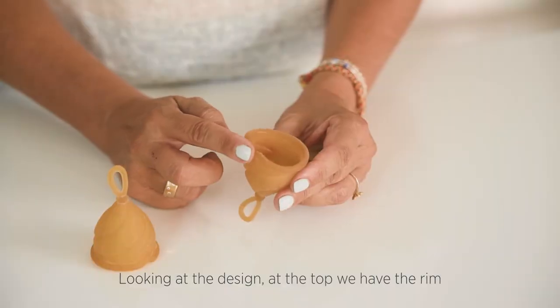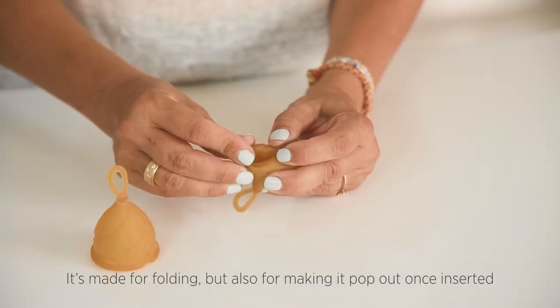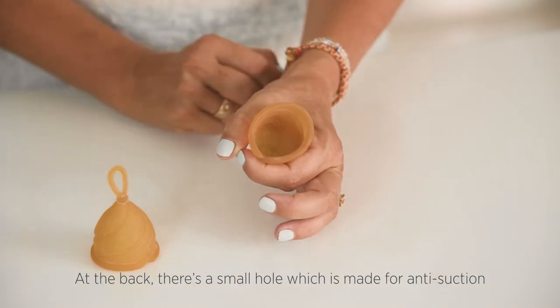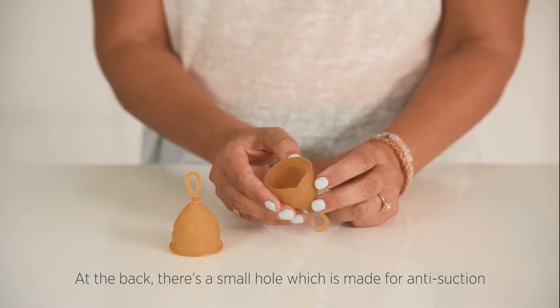Looking at the design, at the top we have the rim. It's made for folding, but also for making it pop out once inserted. At the back there's a small hole, which is made for anti-suction.